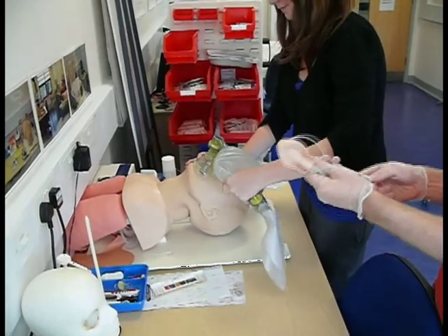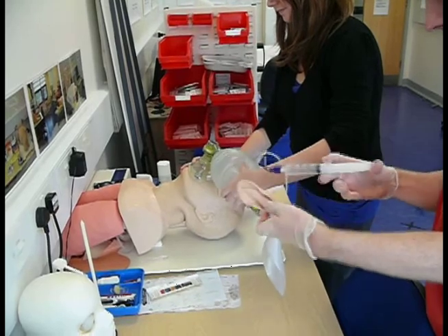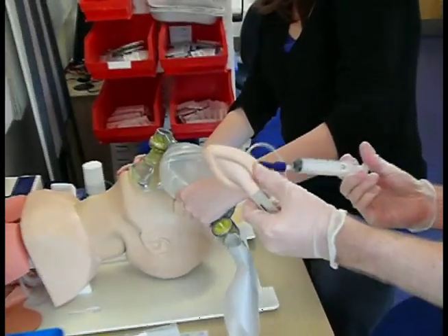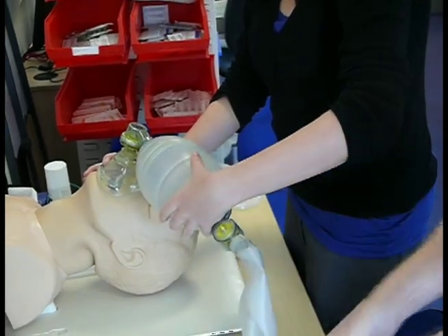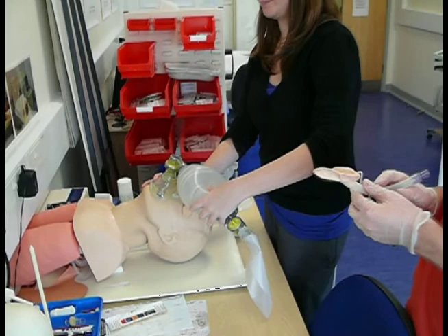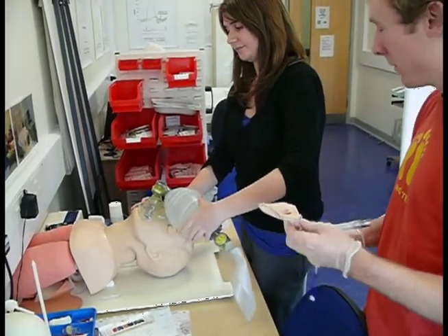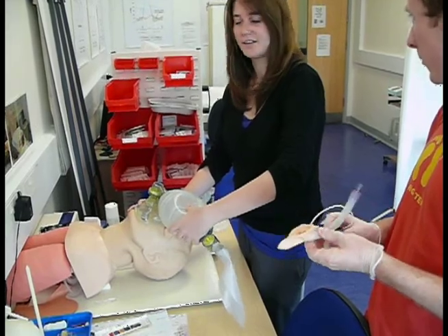So I'm going to check that this works properly. In a second I'm going to ask you to step aside whilst I insert this laryngeal mask airway, and if I'm unsuccessful I'm going to need you to step back in and do more respirations.